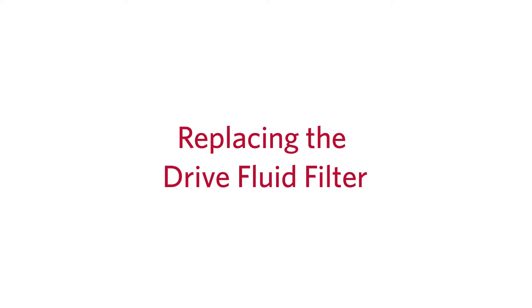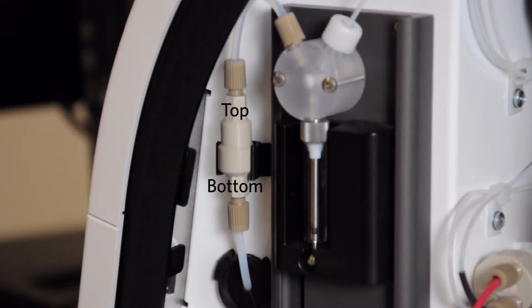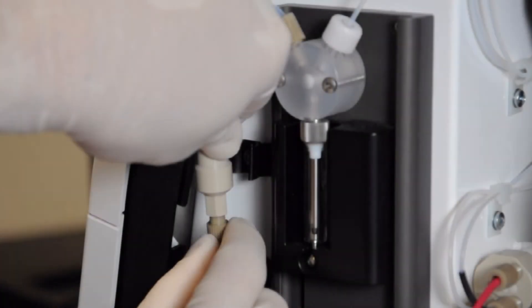Next, we will cover replacing the drive fluid filter. Locate the drive fluid filter to the left of the syringe pump. Notice its orientation and gently pull the filter from the mounting bracket. Unscrew the fittings from the bottom and top of the filter.